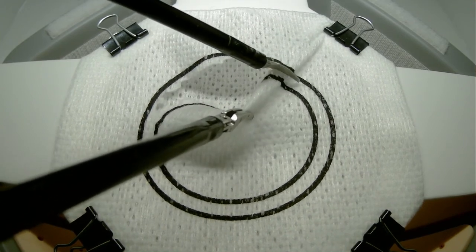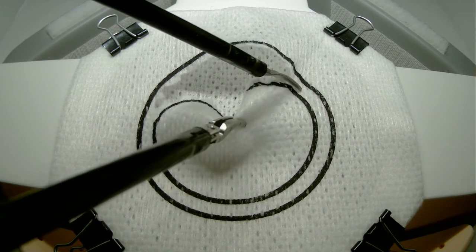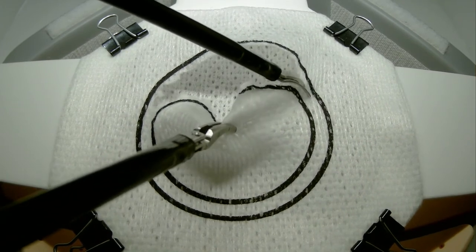The Maryland graspers are utilized to provide tension on the gauze during cutting.